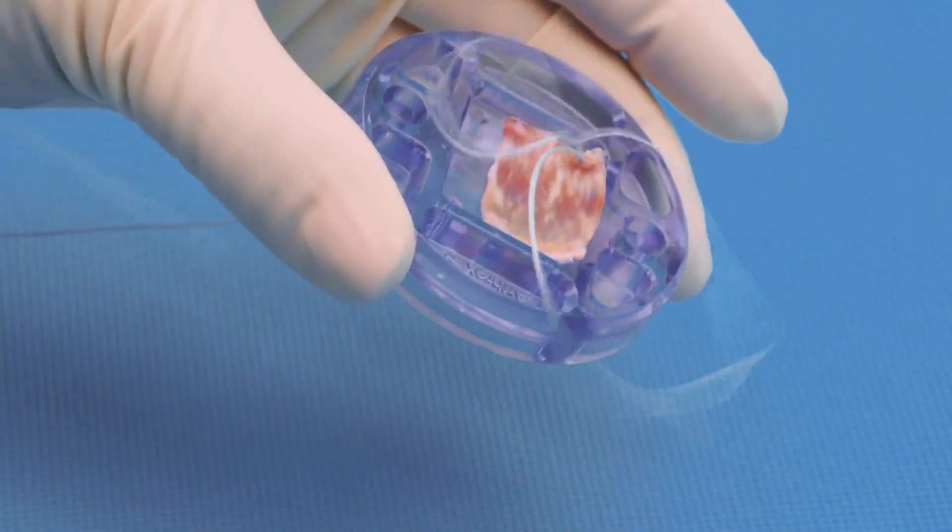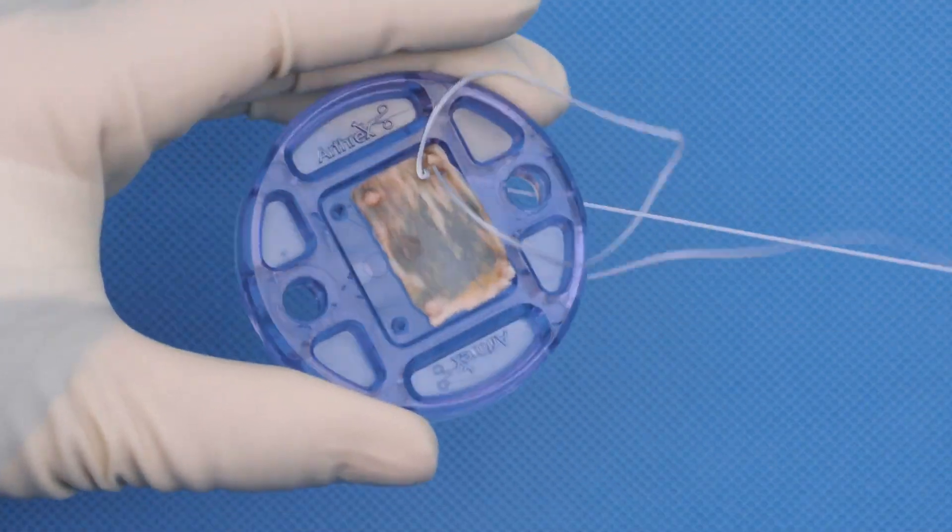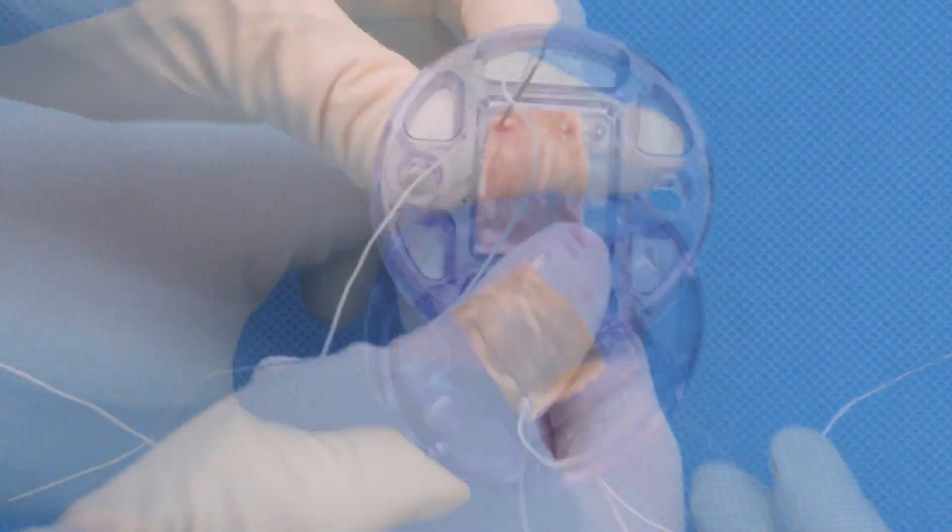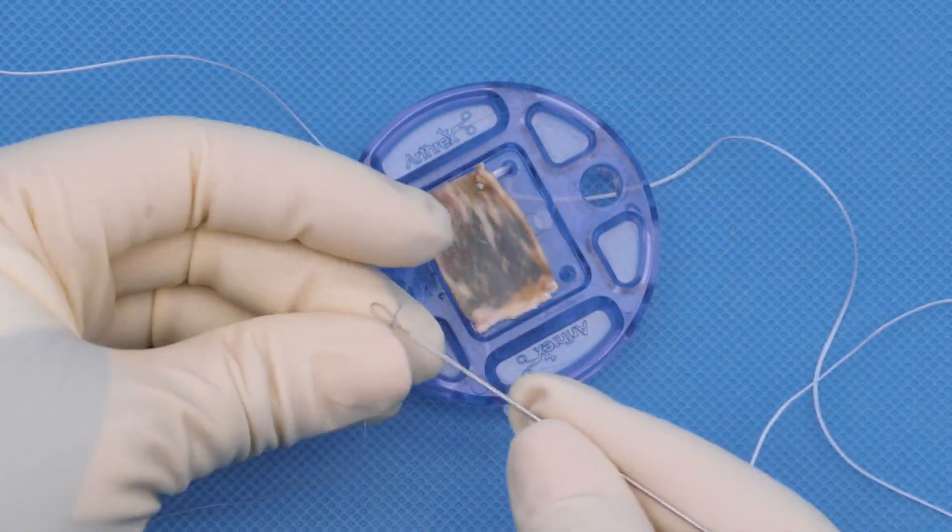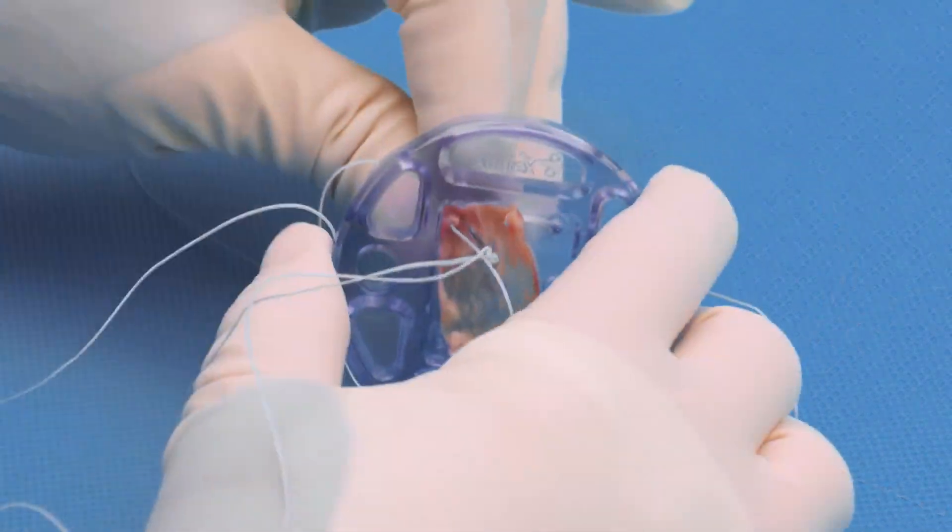Both passes of the mattress stitch will go through the same hole in the compression plate. Repeat on the opposite medial corner of the graft with the same keith needle, but now with the zero fiber wire suture.